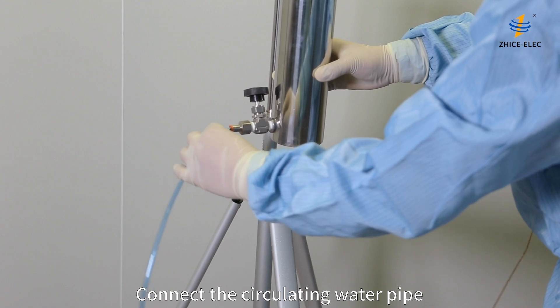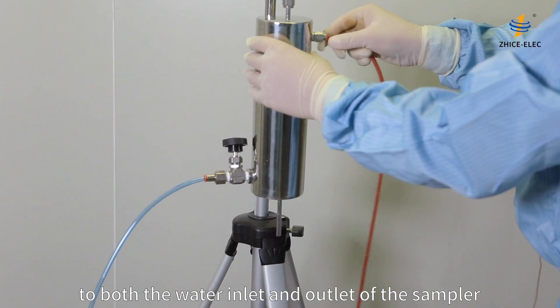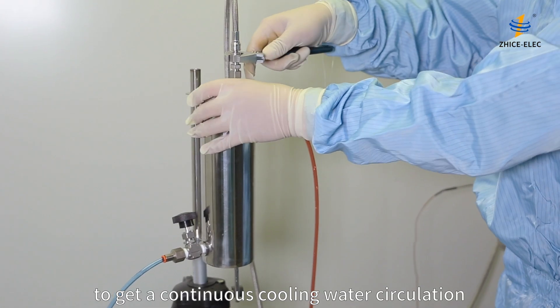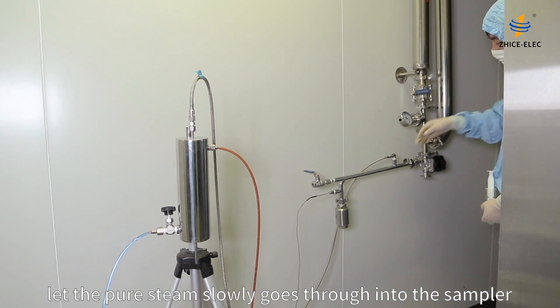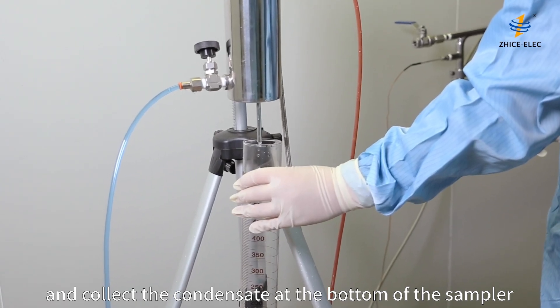Connect the circulating water pipe to both the water inlet and outlet of the sampler. Connect the steam to the condensate sampler to get a continuous cooling water circulation. Adjust the steam valve and let the pure steam slowly go through the sampler to collect the condensate at the bottom of the sampler.